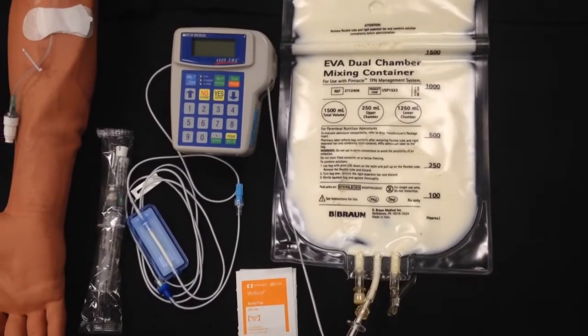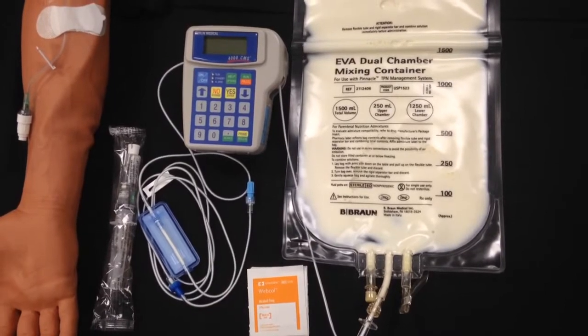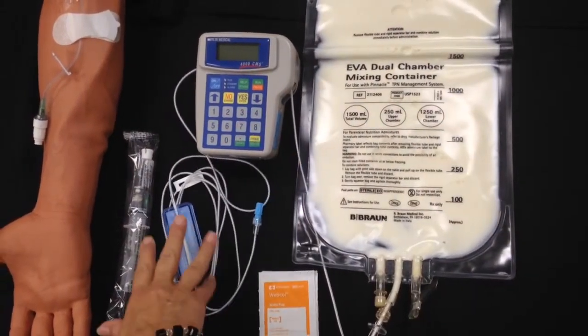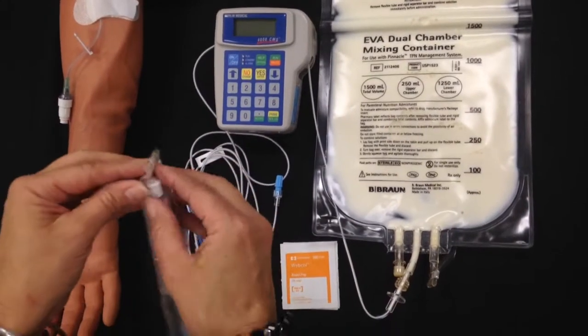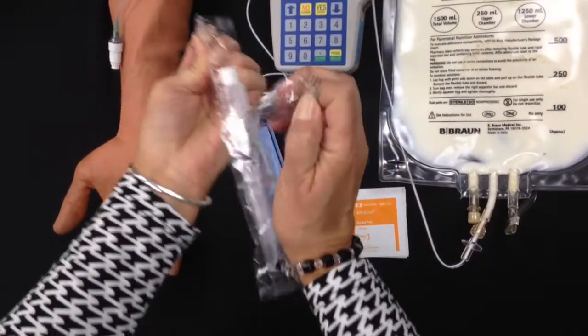Okay, we're ready to connect the TPN bag to the patient. So you need your TPN bag, your pump with a previously primed tubing, some alcohol wipes, and a saline syringe. First, we're going to remove the plastic from the saline syringe.